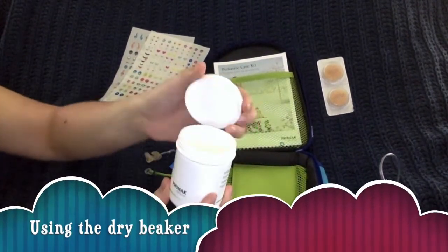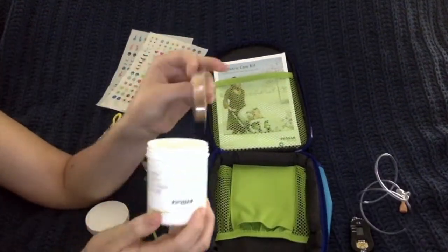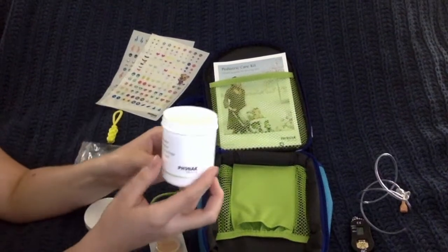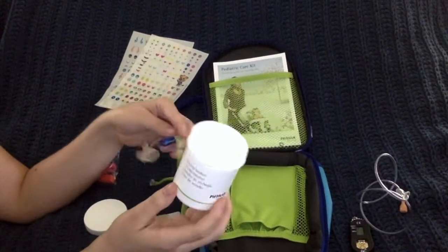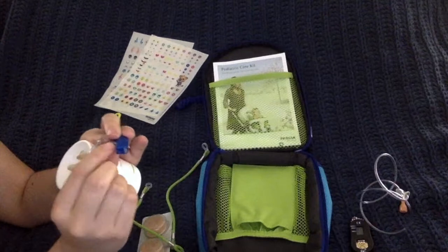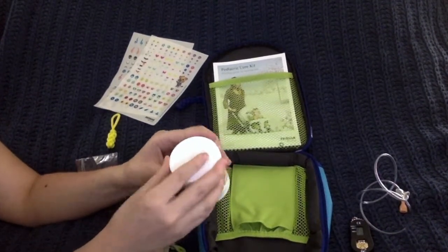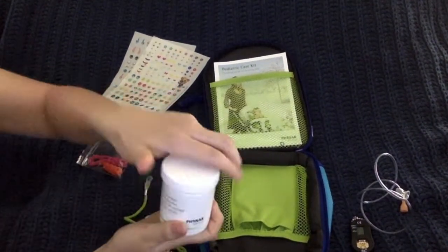The dry caps go into the bottom of the dry beaker. You just pop them out of their casing and put them in the bottom. And these dry caps is where you should be putting your hearing aids every night to help dry off any moisture that could have accumulated throughout the day. It is important to make sure that when you're putting your hearing aid inside the dry beaker at the end of the day, the door is all the way open and the battery is taken out.